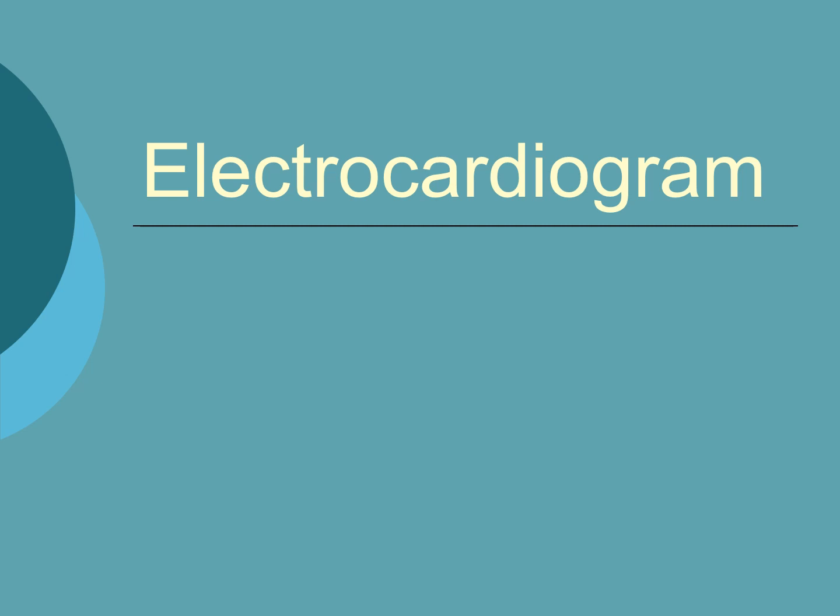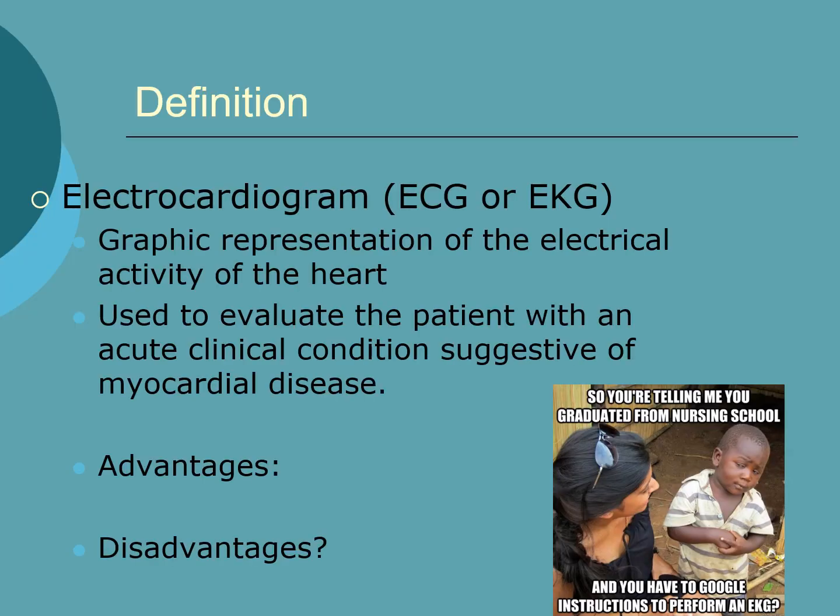Okay, welcome to the electrocardiogram. This is the EKG1 PowerPoint. So the big thing I want you to start with is the definitions over here. An ECG or an EKG is just representing the electrical activity of the heart.